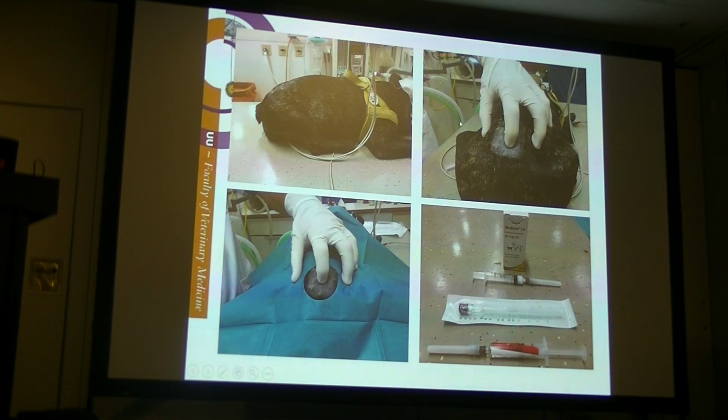It is easy, of course, to use imaging, but it's not really necessary because you can nicely orient yourself on the landmarks. So here I palpate tuber coxae, I palpate L7 spinous process. I work with gloves, so this is a spinal injection, so you need to take aseptic procedures. We put a little drape around it, we prepare our medication. So this is the Moderin, the methylprednisolone.